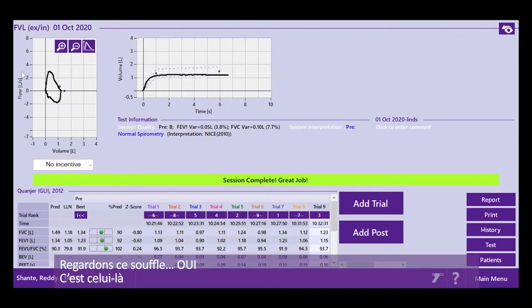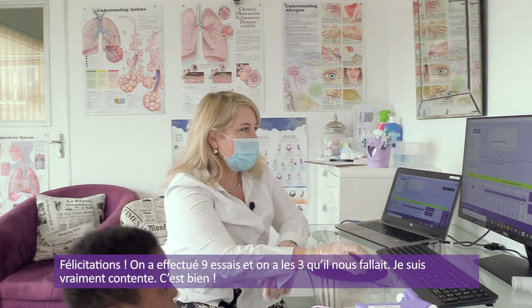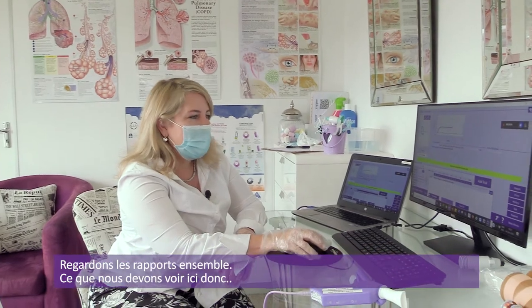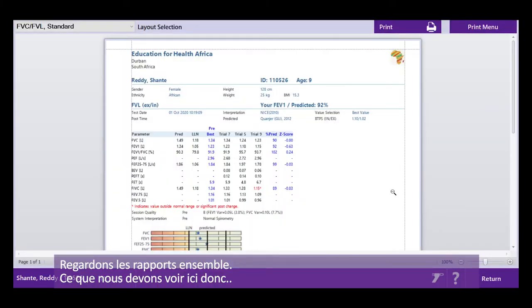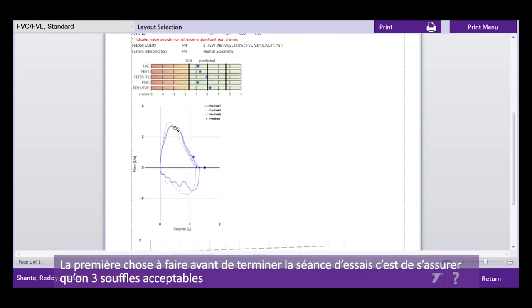Okay, so let's have a look at that blow. Yes, that's the one. So well done. We've conducted 9 trials and we've got our 3 blows that we need. So I'm really, really happy with that. Well done. Let's look at the report together. So what we need to see here then, first thing we do before we finish the testing session is we want to see that we have 3 acceptable blows.